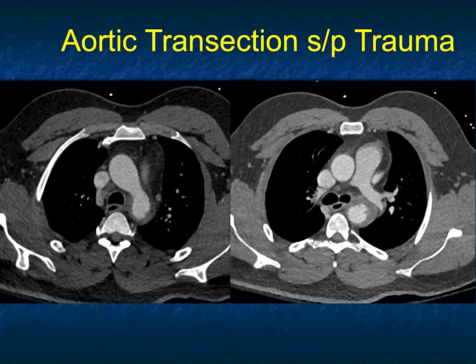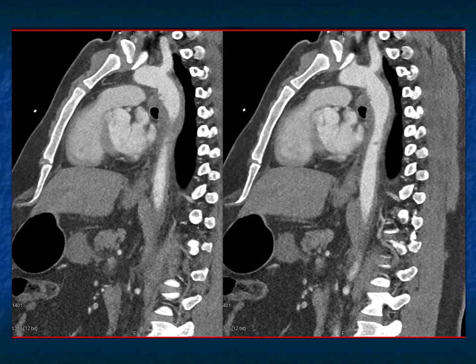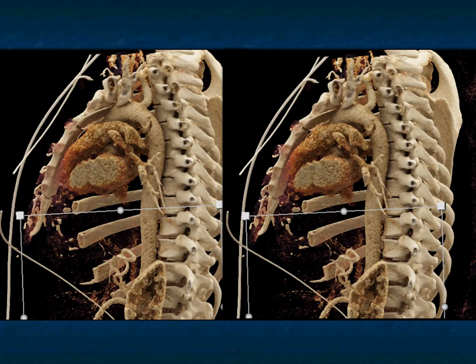Here it is on the sagittal views, showing nicely the length of the intramural hematoma. When you're looking at the aorta, you've got to look at the coronals and the sagittals. Often, particularly with vascular injury, the 3D volume rendering is particularly valuable in looking at extent, involvement, and presence. And here it is — cinematic rendering. Look at that beautiful example of a dissection past the left subclavian artery. Patient was very lucky — stent was placed and patient did great.